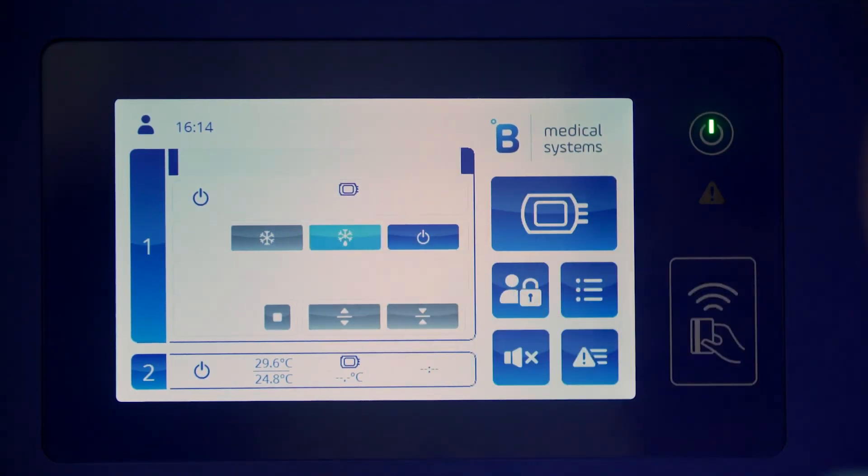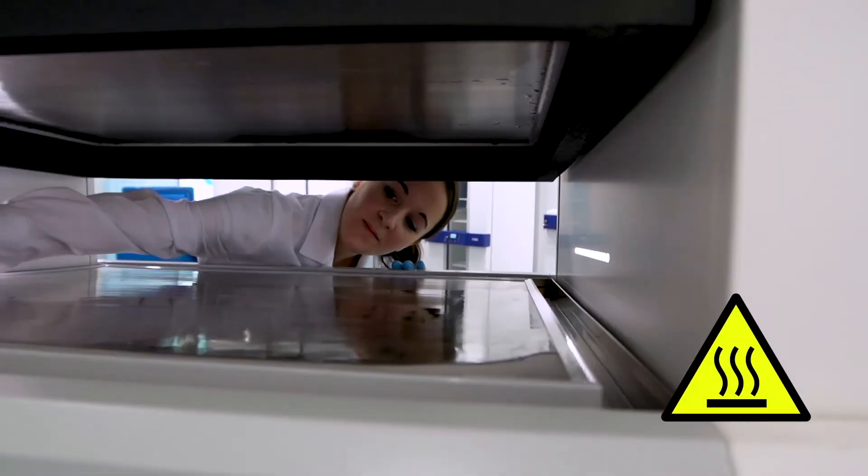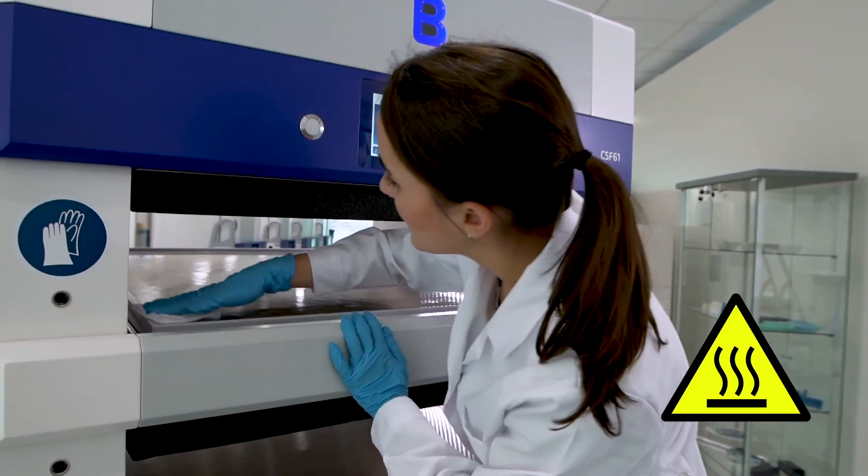Once you are done, defrost the plate before switching off your contact shock freezer. Clean and disinfect for future use.